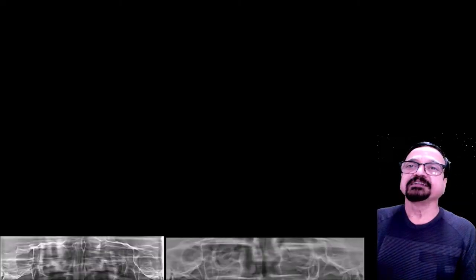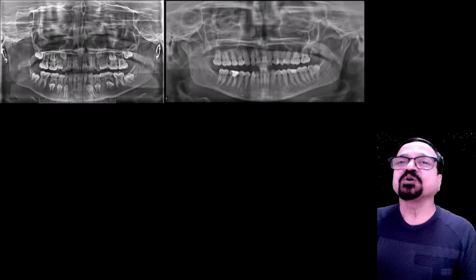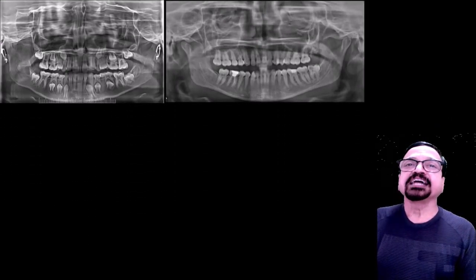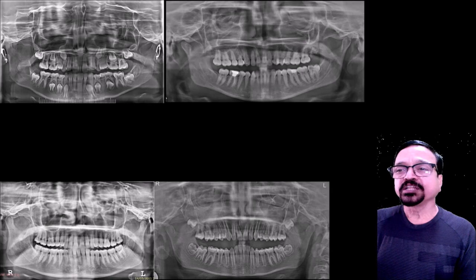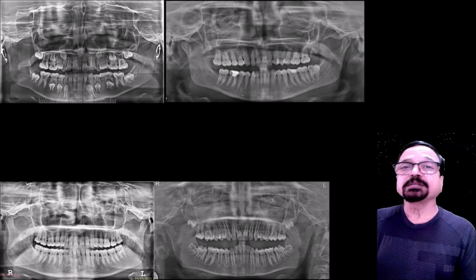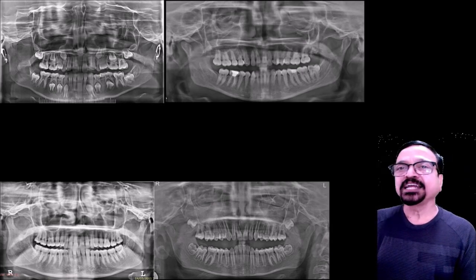Now the cassette which has come out goes to the reader. Now here are the radiographs of the O.P.G. The excellent anatomy of the jaw, excellent mapping of the tooth is achieved by O.P.G. Both TM joints are seen here and you can see all the tooth, then you can see all the pathologies of the tooth, root of the tooth. It is best for the mandible, but sometimes it does to some extent suffice for the hard palate, but it is usually designed to detect pathologies of the mandible.